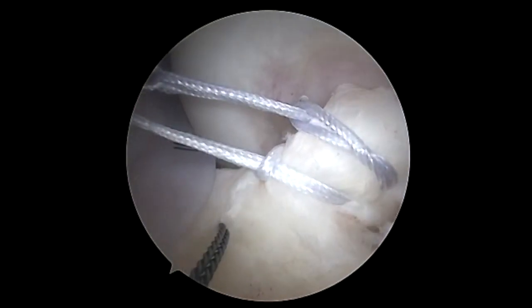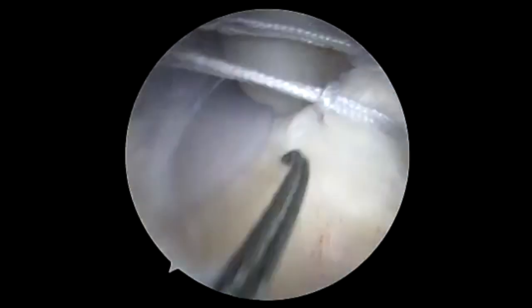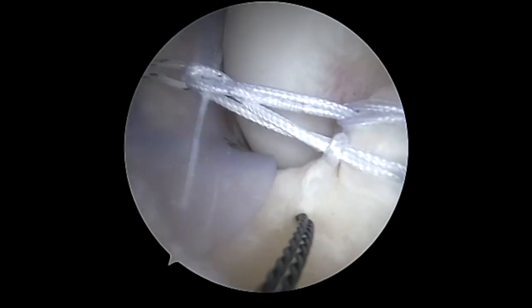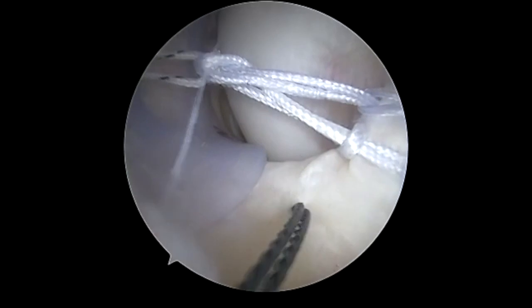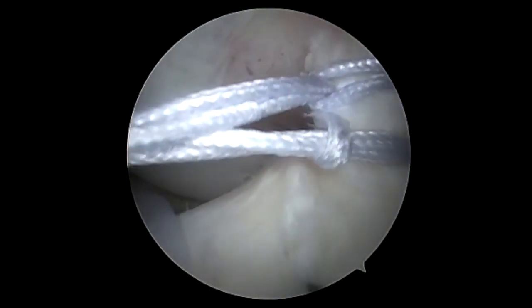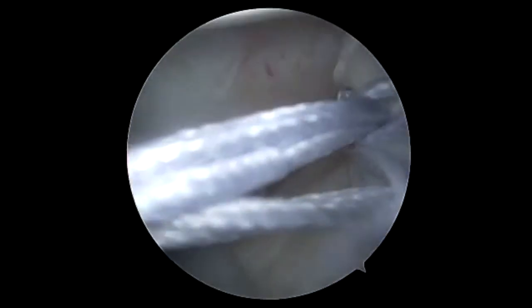We've already passed the first fiber ring through the tie-rope device. Now we're passing the second fiber ring through the tie-rope device and checking to make sure these slide. We're going to steps two and three as shown on the website. Following this, we've engaged the entire tie-rope device.